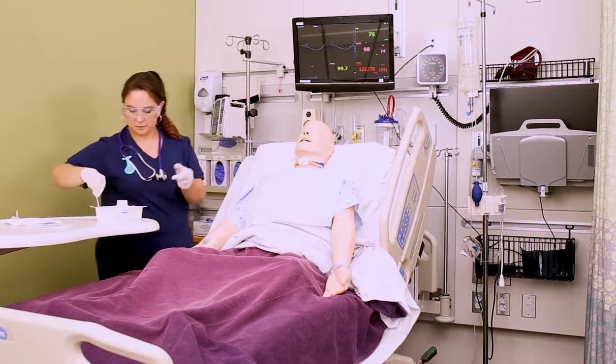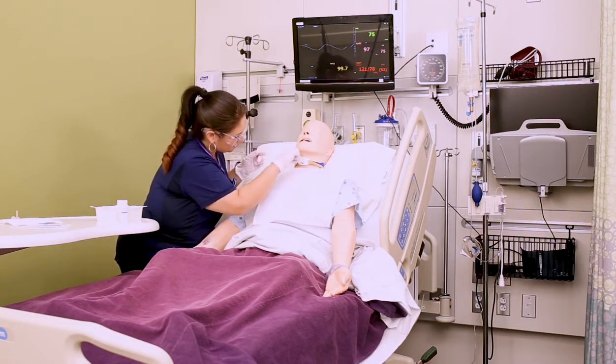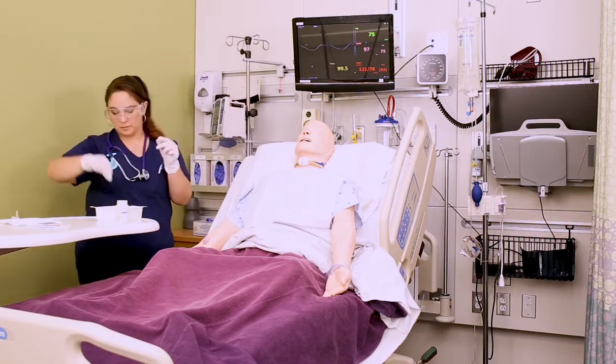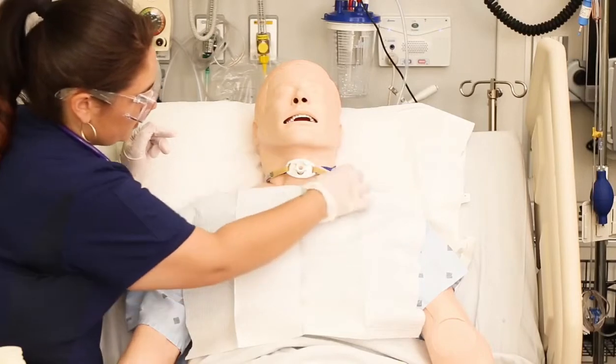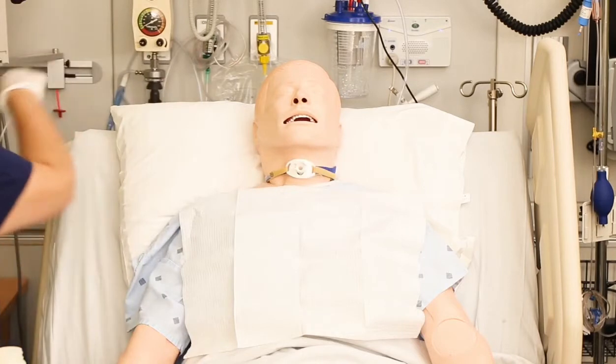So depending on the patient, how long they have had the tracheostomy, and how long it's been since trach care, you might need to use 3 or 4 of these cotton tipped applicators or pipe cleaners to make sure you get all of the secretions off. Remember, all those secretions are out of the lungs. If we leave them there in that area, we're just increasing the risk for infection and skin breakdown.